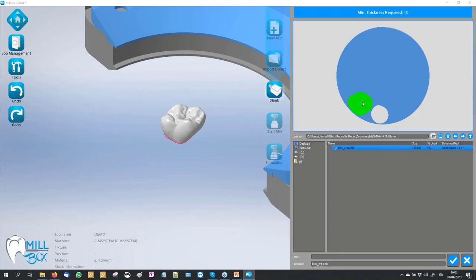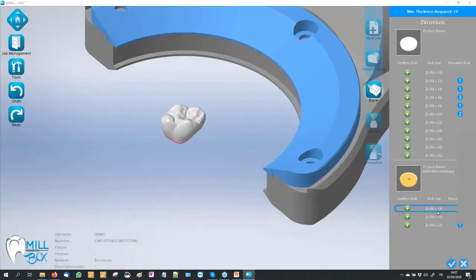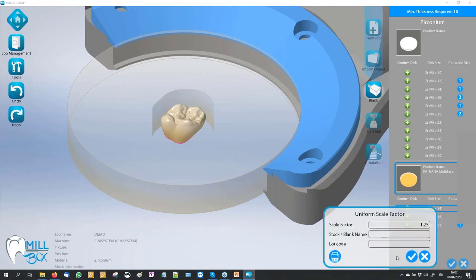The software brings the object to the best position following the configuration of the machine and also the features it recognizes on the object. If I want, I can directly confirm or create a new. When I go to confirm, the software asks for the right shrinkage factor and the name of the stock, and if I want I can also insert the lot code for recognizing our job over time.